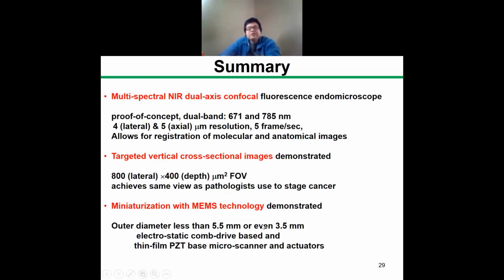So then, based on all these concepts, later we basically enhance every single element in the hardware. For example, the optics for the endomicroscope, multicolor or higher resolution based on different architectures, or developing a better contrast agent. Right now, we are also working on other contrast agents, for example, HA targeting CD44, which has been recently published in ACS journals.